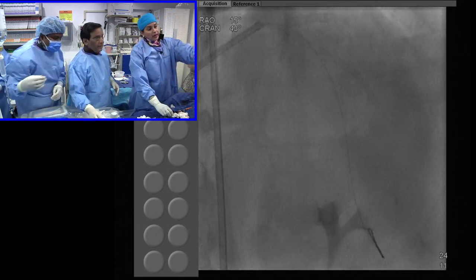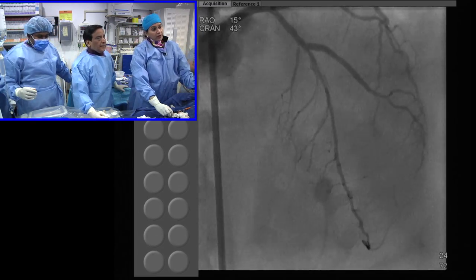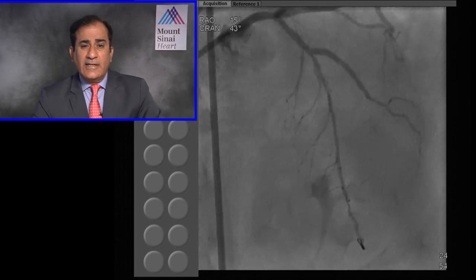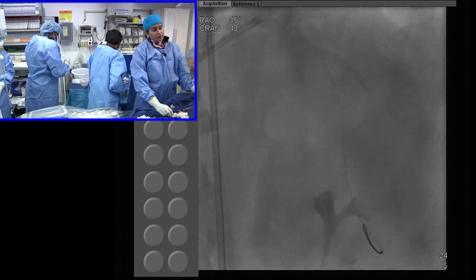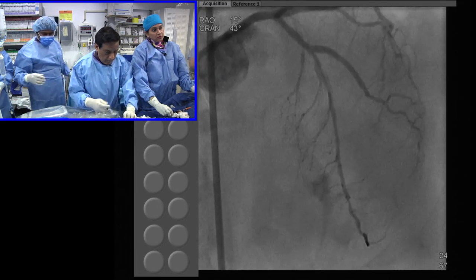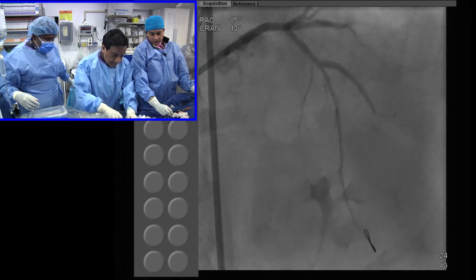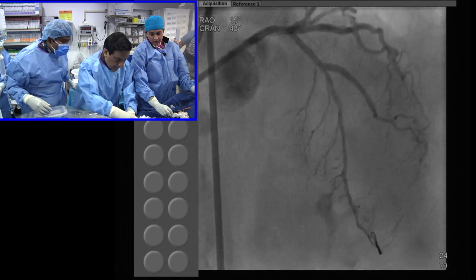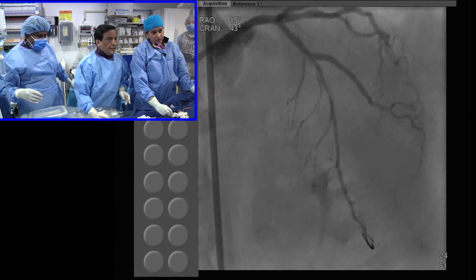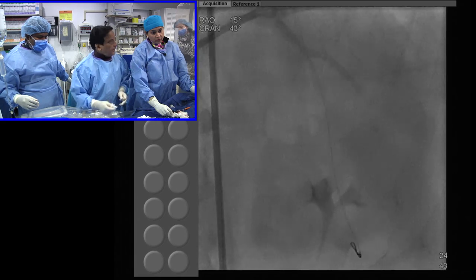So Samir, you're starting at the third septal, coming up to the first septal. Would the 28 cover it? Would it help to give some intracoronary nitro at this stage? Your pressure was on the low side. Yes, definitely will give, and then flush it. Yeah. So now we are good. So the question is, we can do two ways. I think we should put one distal first. We are giving nitro. 25 by 28 now. Or 18. 18 is fine.